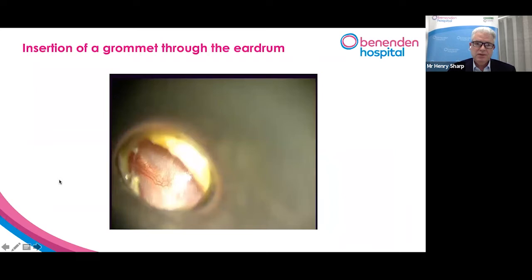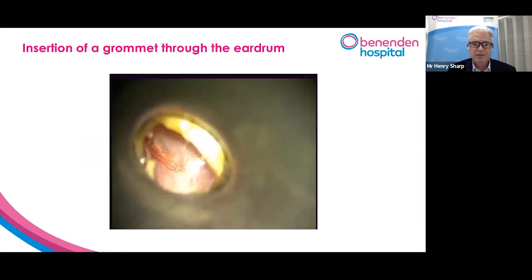This is a grommet. For someone who has glue ear, this is a little video of a grommet. So that's your ear drum. If you put it in perspective, that's smaller than your little fingernail. So we're looking down a microscope, down a little speculum there.